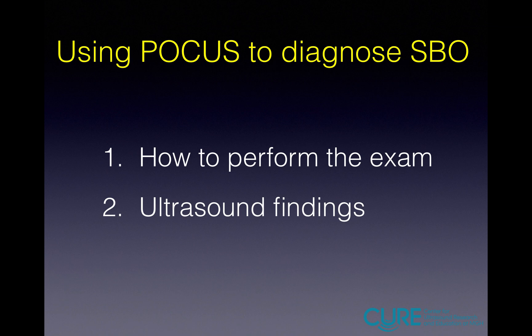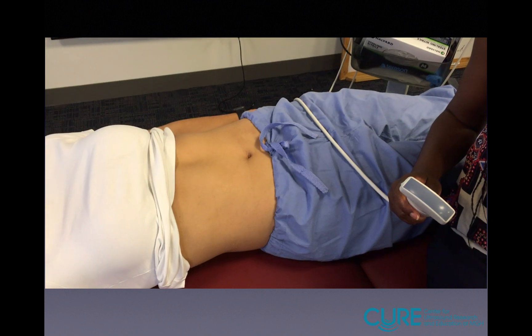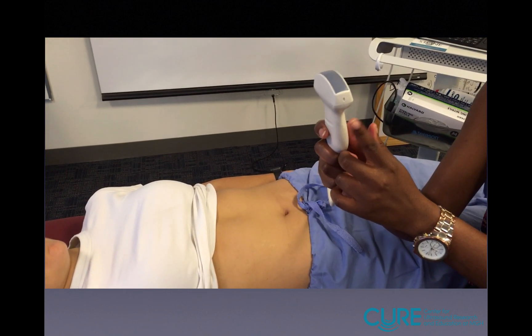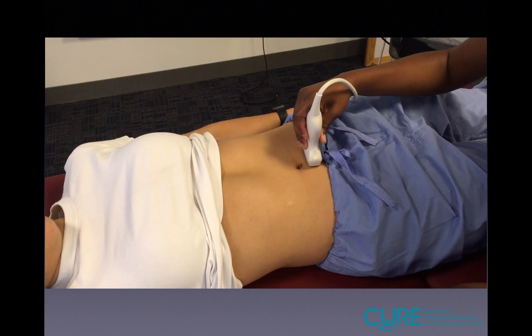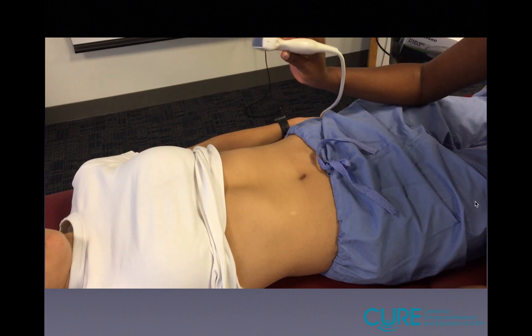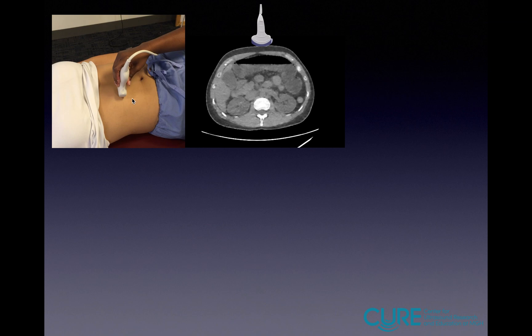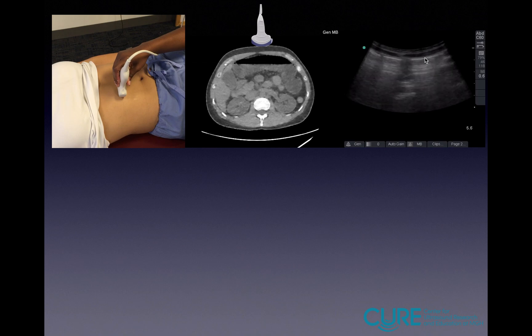Now that we know that point-of-care ultrasound is very good in diagnosing SBO, the question is: how do we perform this exam and what are the pertinent ultrasound findings? Classically, we have been taught to use the curvilinear probe and to scan the entire abdomen, starting from the right lower quadrant and ending in the left lower quadrant — something known as 'mowing the lawn.' However, if you're looking only anteriorly and there are air-fluid levels, all you'll see is air. Air in ultrasound does not look like bowel — you see things that look like A-lines coming from within the bowel, obstructing your view of the dilated loops.